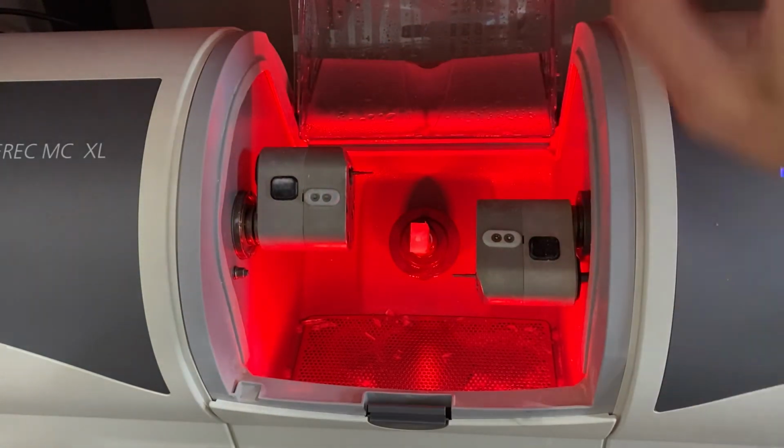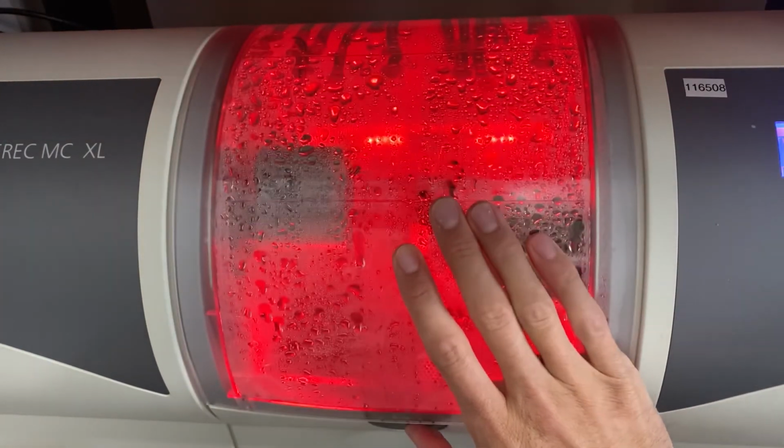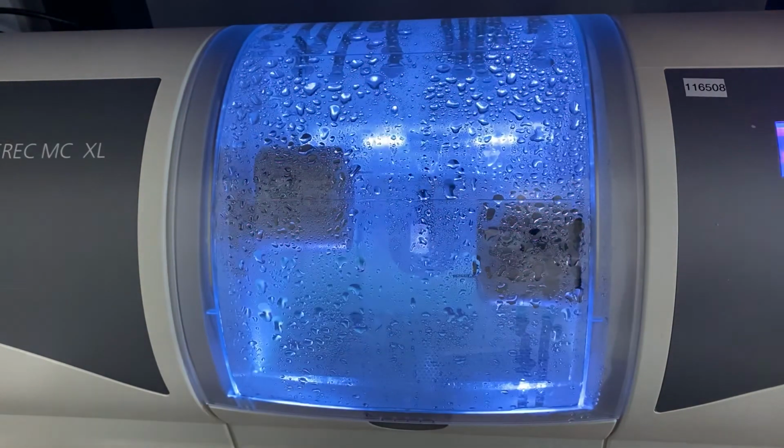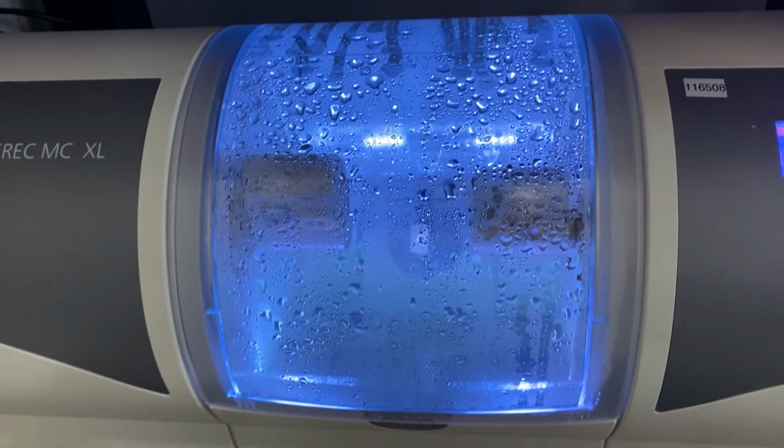So then you close your top, push the button in a little bit, let it pop back down, and then we'll press start. And that would be, normally you would just let things continue on. And that's how you do it.